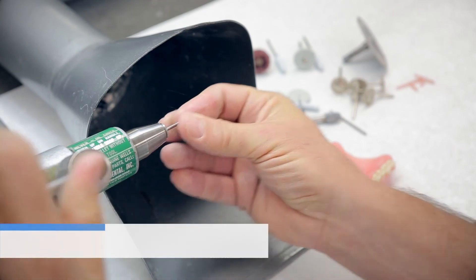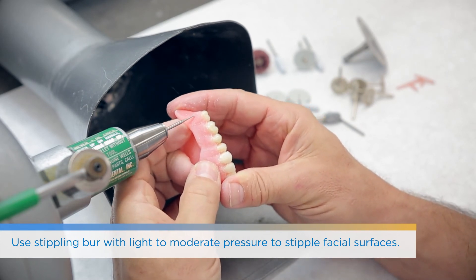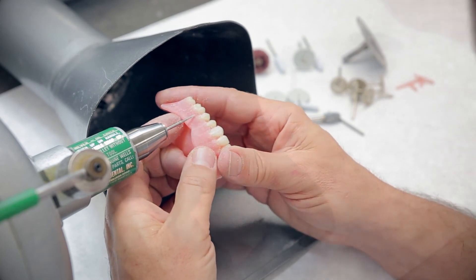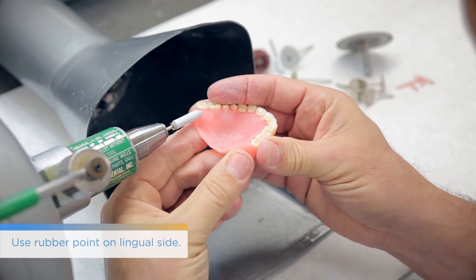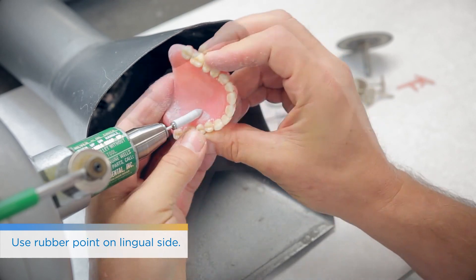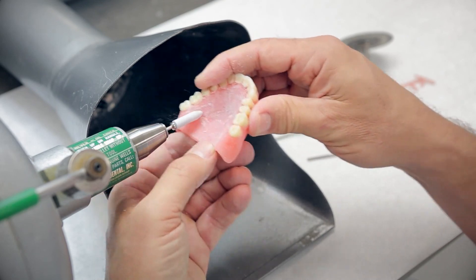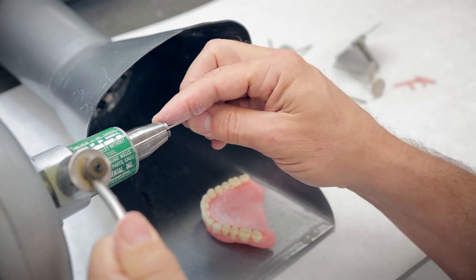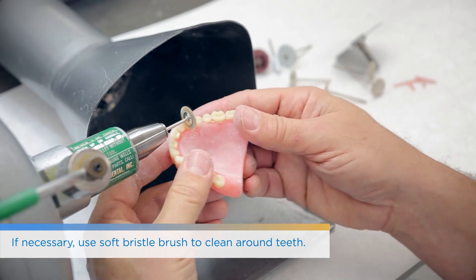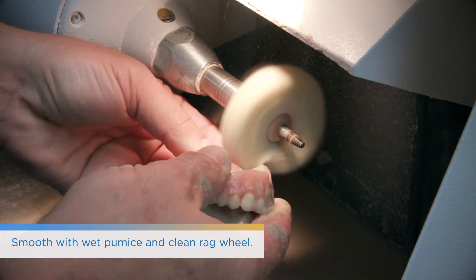Following support removal, do your usual finishing — if you'd like festooning, stippling, or other characterization, add that in. The material now acts very much like denture acrylic, so you're able to complete and finish it the same way you typically would. You can see the lab technician adding stippling and characterization to the facial aspect, then using rubber points on the lingual side before starting to polish.